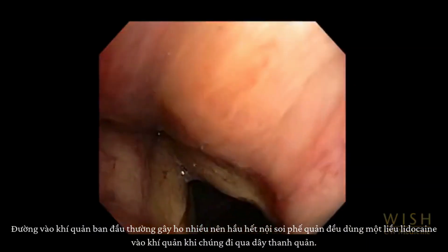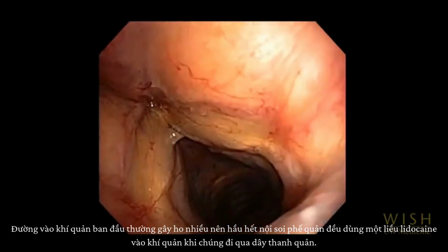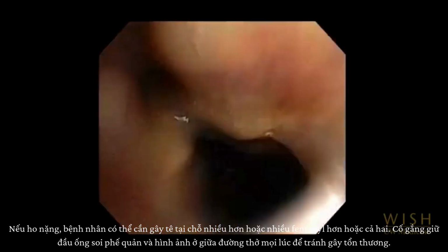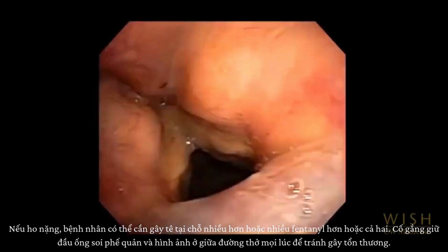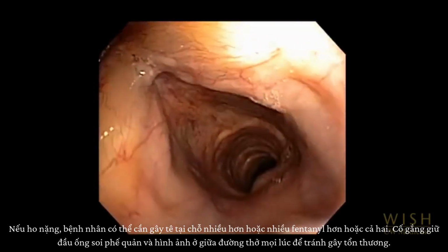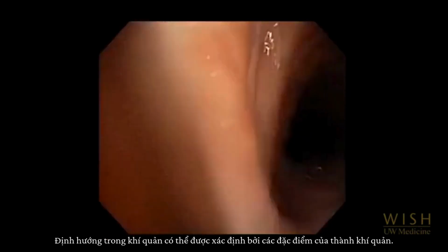Initial entry of the trachea often causes significant cough, so most bronchoscopists administer a dose of lidocaine into the trachea once they pass through the vocal cords. If cough is severe, the patient may need more topical anesthesia or more fentanyl or both. Try to keep the tip of the bronchoscope, and therefore the image, in the center of the airway at all times to avoid causing trauma.